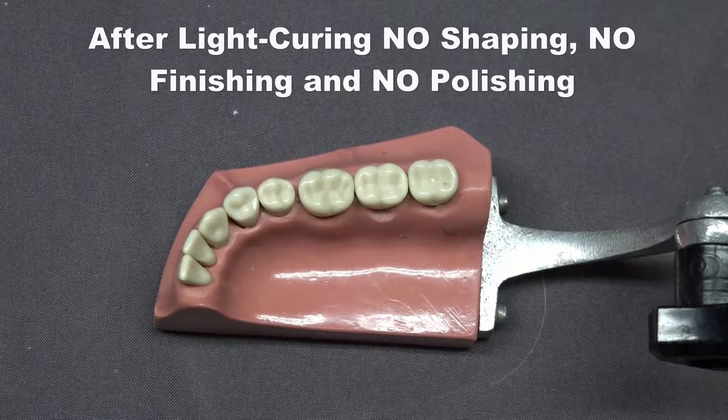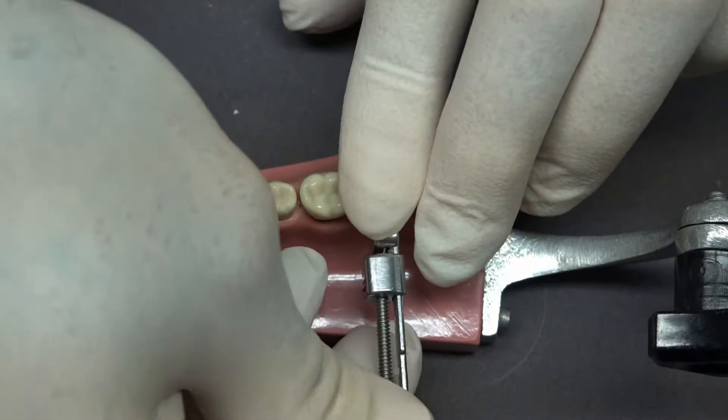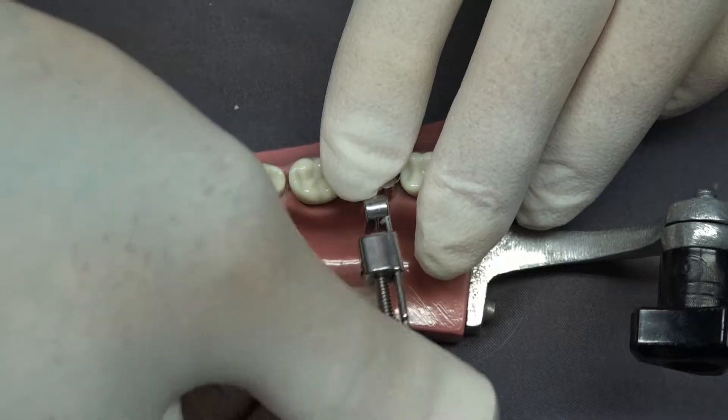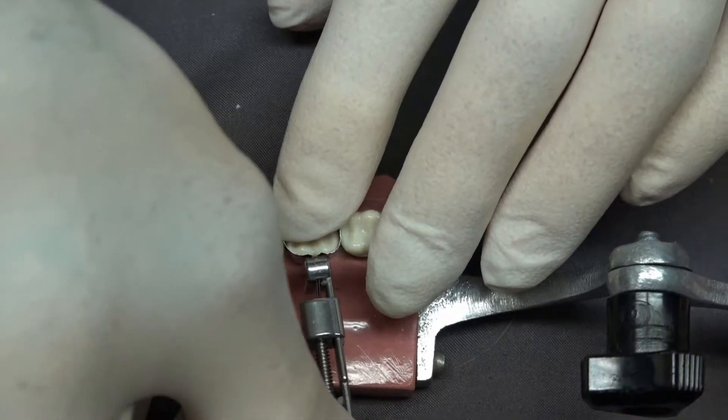The first step is, after anesthetizing the patient, to put on a matrix band. This happens to be a Toffelmeyer — it's the easiest one to get on. Just tighten it up normally.